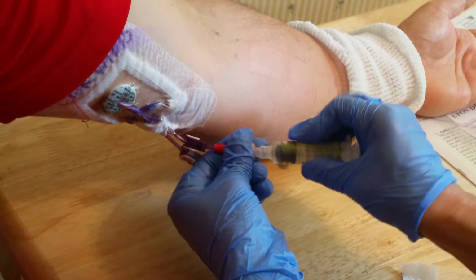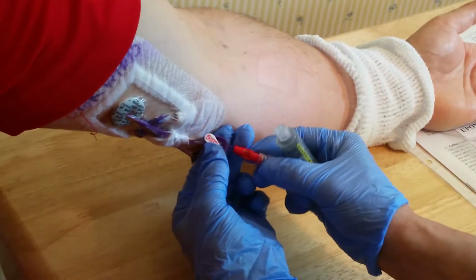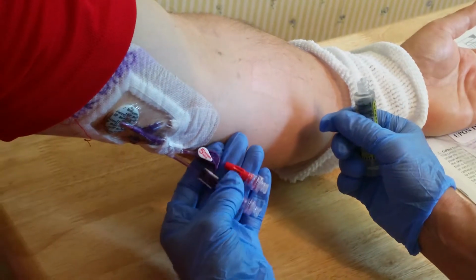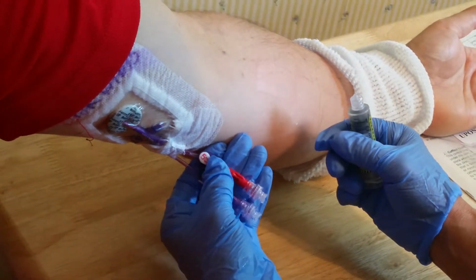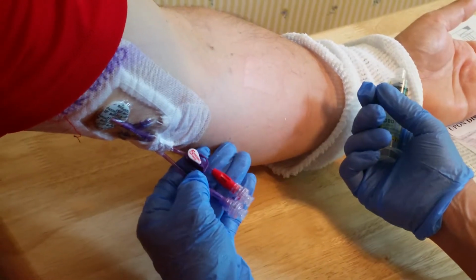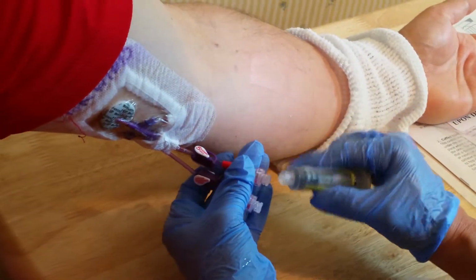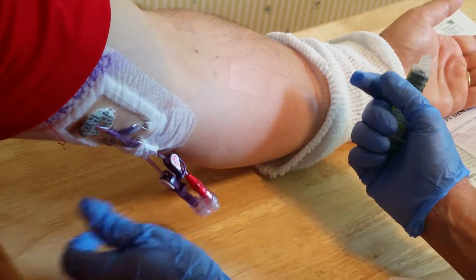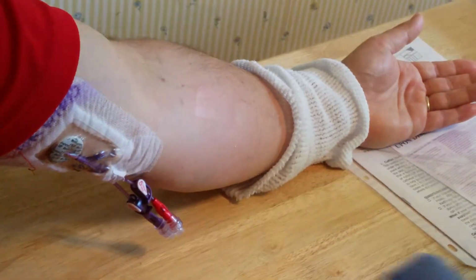I feel like I'm going to miss a step. That's why I'm filming it, you know, and that's why we've got everything. Really, the most important thing is unclamping it when you're using it, clamping it when you're not using it. And then these guys just plug right in and out. And then when the nurses come, they'll change those caps once a week. And then cleaning. Yep, and if you just remember to always clean it before you touch it, then you know you're covered.